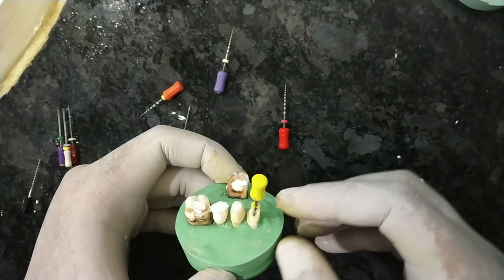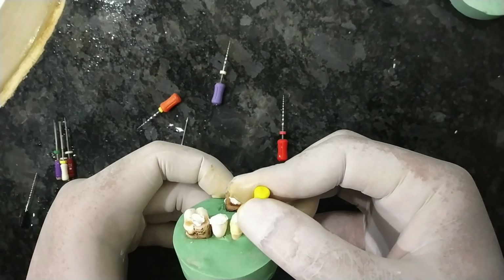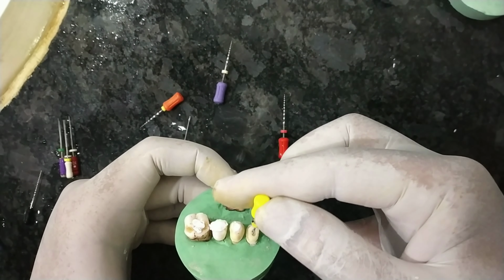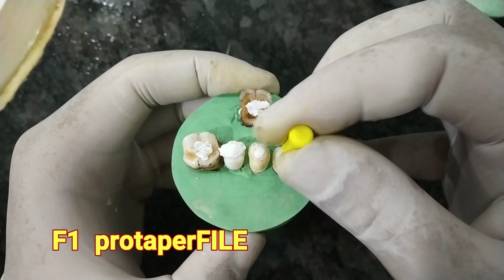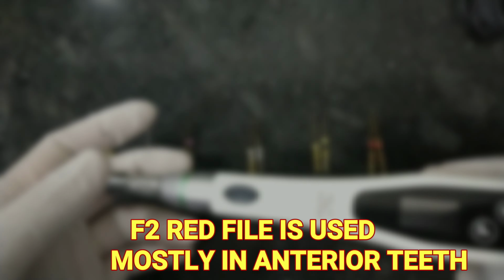This F2, this is the F1 file, 3/4 rotation and reverse rotation and pull. Similarly in the palatal canal, as you can see here, 3/4 rotation, 90-degree rotation back and pull. So you see how nicely the canal is being prepared of both buccal and palatal sides.